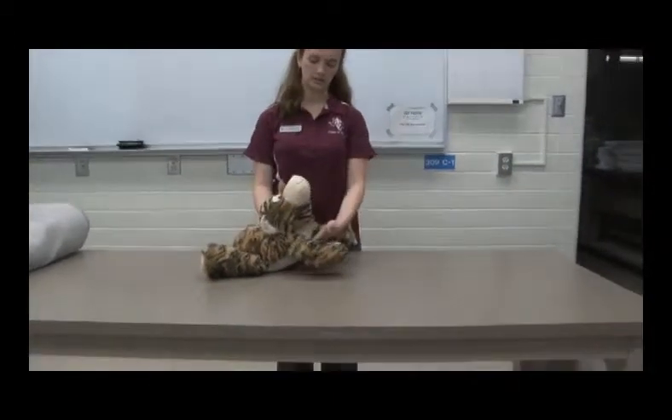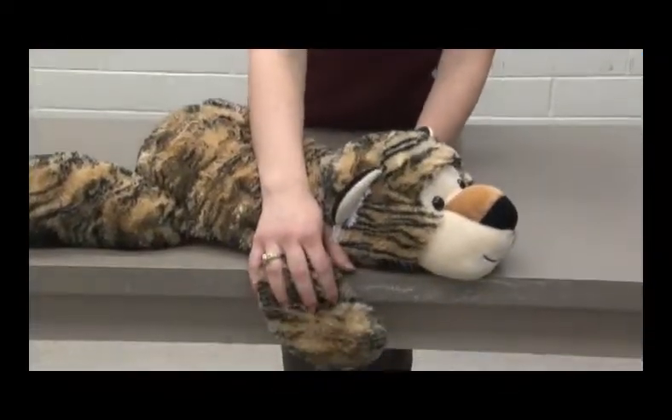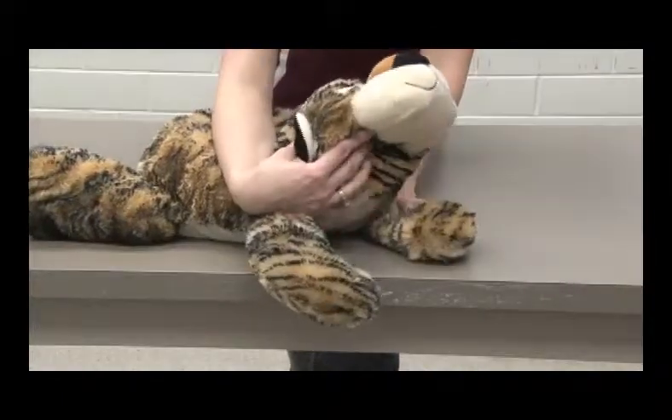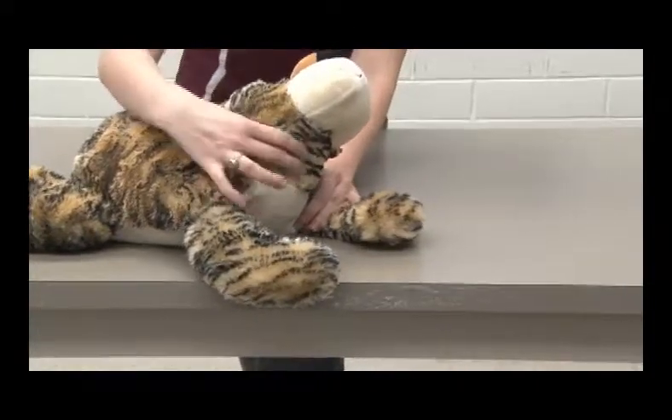You're going to leave them in sternal recumbency, which is where their sternum or breast bone is touching the table. You're supposed to have their paws over the edge of the table — this is really too wide of a table. You have their front paws over the edge of the table and then you would lift their head and hold it against yourself, so that the veterinarian can get to their jugular vein.